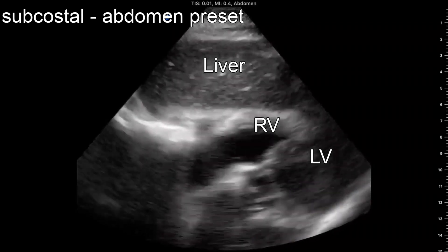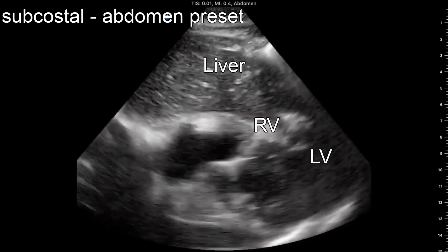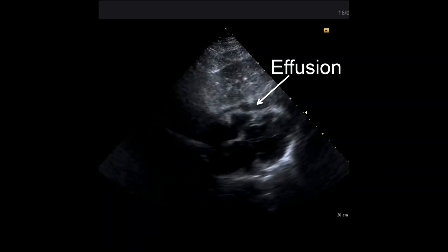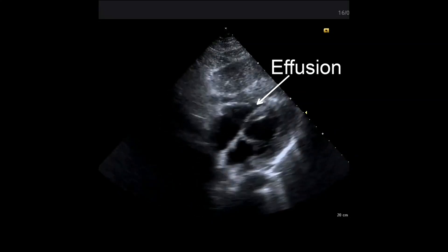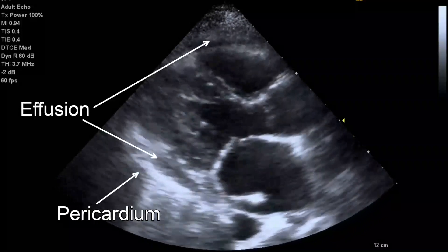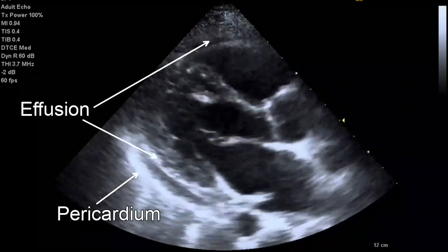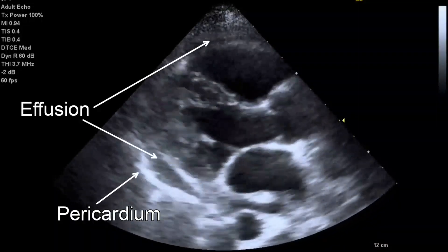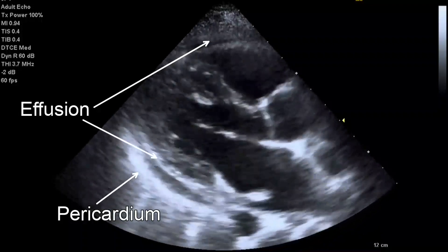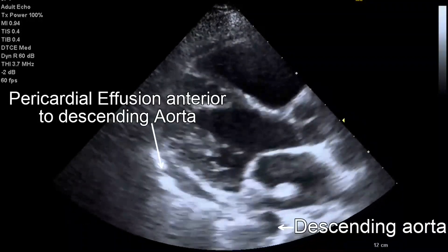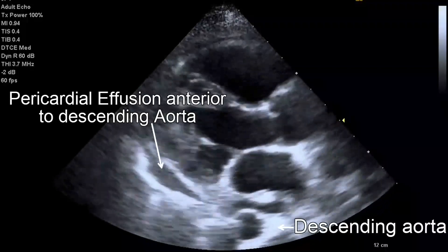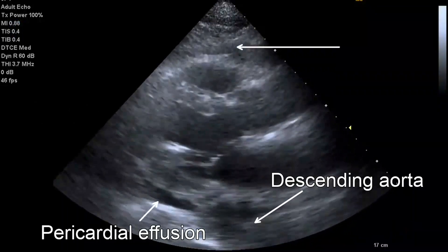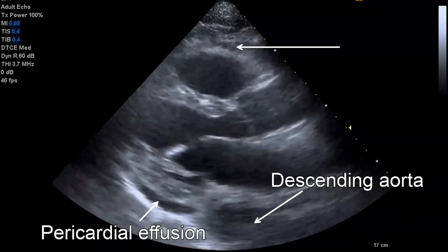From the subxiphoid orientation, fluid will initially be seen between the right side of the heart and the liver, which is the most dependent area visualized. In the parasternal orientation, fluid will initially be seen posteriorly as it outlines the free wall of the left atrium and ventricle, but may also be seen anterior to the right ventricle, particularly in circumferential effusion. The descending aorta is an important landmark for differentiating pericardial from pleural effusions: pericardial fluid collects anterior to the descending aorta, while pleural fluid will be seen posterior to this level.